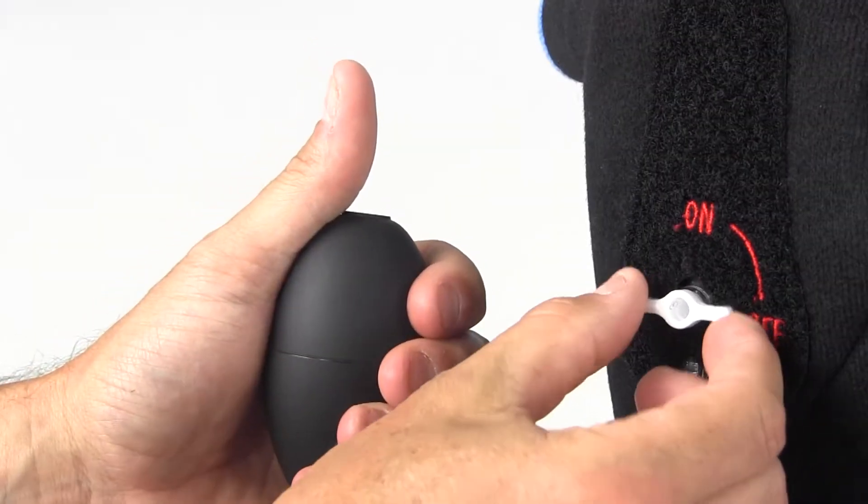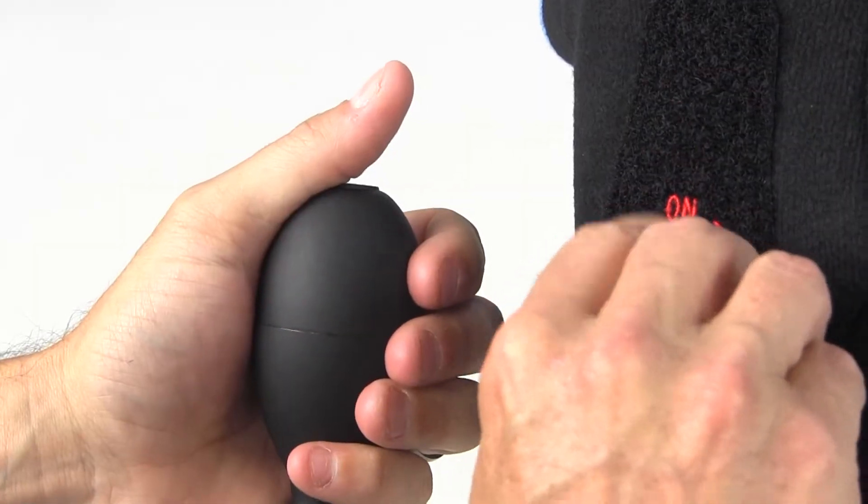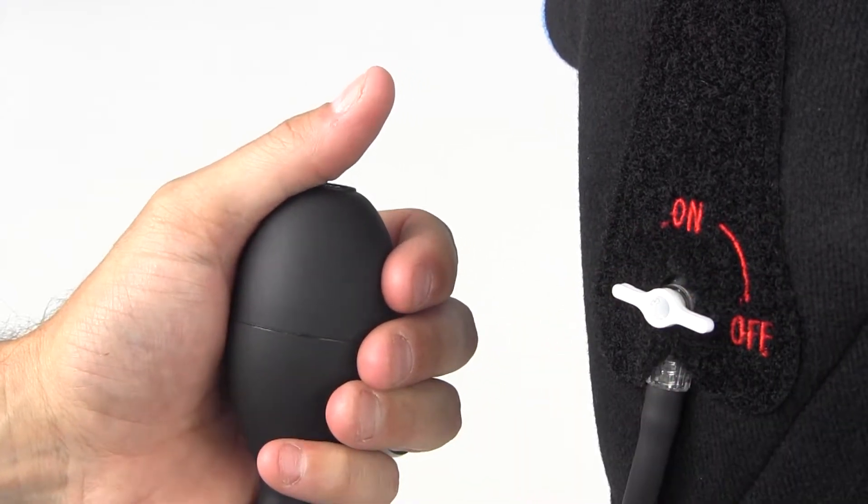Switch the valve to the on position and pump to your ideal fit. When you're done, switch the valve back to off and simply twist the pump to detach.